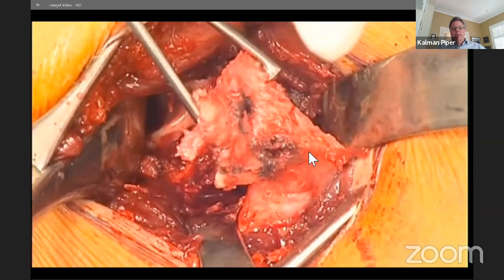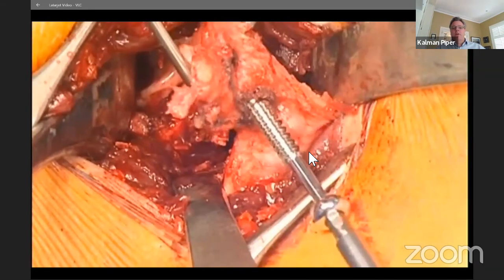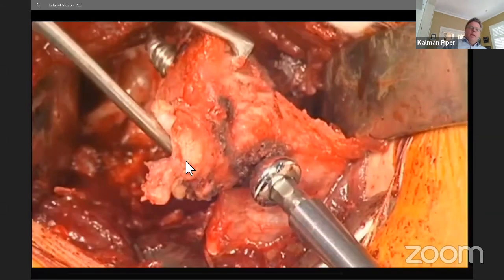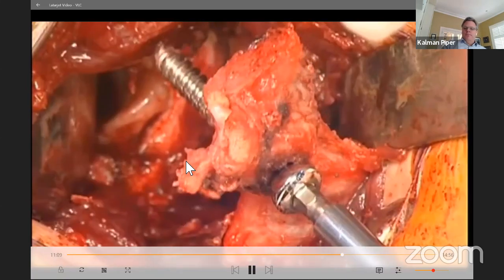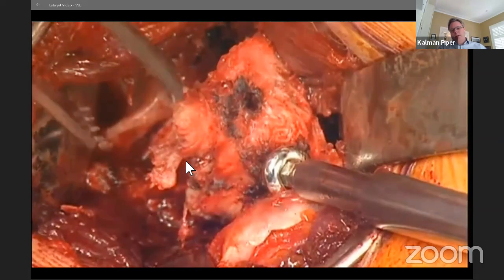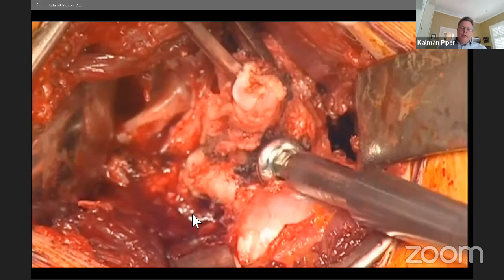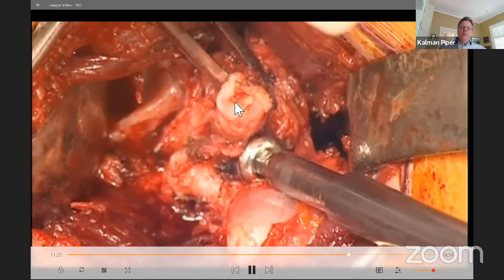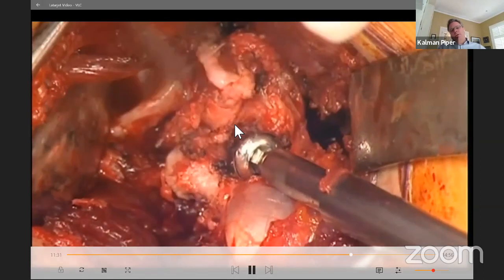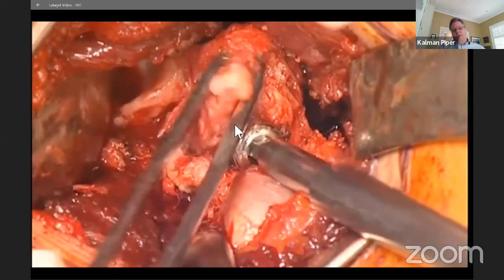So one drill hole has been made. He places a partially threaded AO screw into the coracoid graft, the inferior hole first. It's partially threaded so he can insert it all the way. That is now inserted into the inferior hole, only loosely to begin with. Then the graft can be rotated on the inferior screw to ensure that the graft is either flush or a little medial to the joint surface. You don't want it to be proud or jutting too far laterally and rubbing or impinging on the humerus.